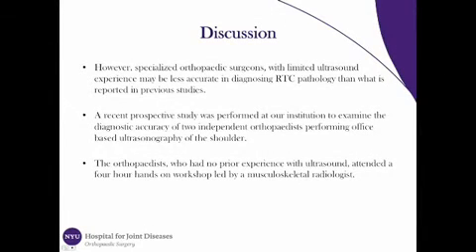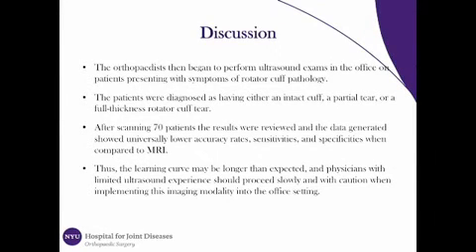However, specialized orthopedic surgeons with limited ultrasound experience may be less accurate in diagnosing rotator cuff pathology than what is reported in previous studies. A recent prospective study was performed at our institution to examine the diagnostic accuracy of two independent orthopedists performing office-based ultrasonography of the shoulder. The orthopedist, who had no prior experience with ultrasound, attended a 4-hour hands-on workshop led by a musculoskeletal radiologist. The orthopedist then began to perform ultrasound exams in the office on patients presenting with symptoms of rotator cuff pathology.